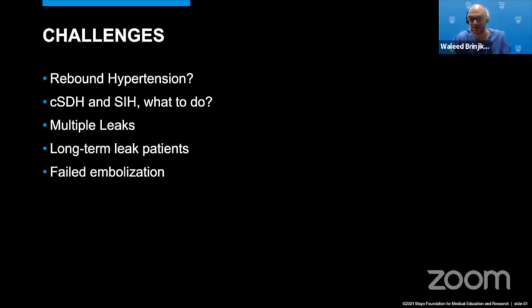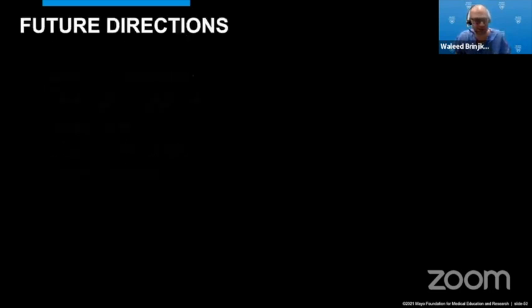If I don't find something, then what I do is I embolize the level above and below where I previously treated, with the idea that you've trapped any route of venous egress from T10, and about 80% of those patients have gotten better. So these are more advanced topics. As I've learned doing more and more, you get humbled the more patients you treat, and you learn a lot of things along the way.